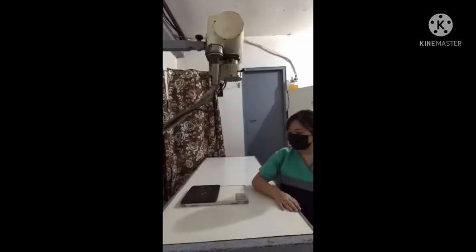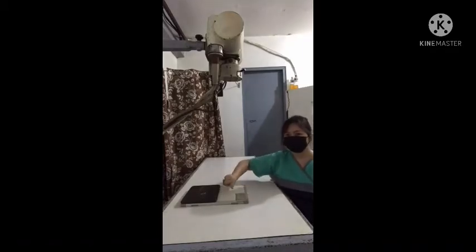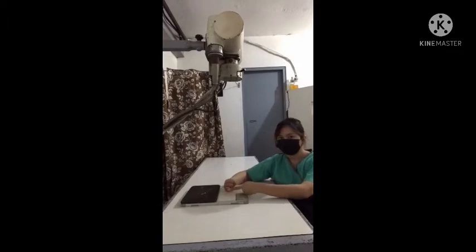You will notice on my demonstration that I use my finger of my opposite hand to immobilize the fourth digit. Again, you have to use radiolucent material that should be held by the opposite hand for immobilization. It just happens that I don't have anything with me while recording that I can use. And you can also place a sandbag as a support underneath the patient's elbow for more comfortability.